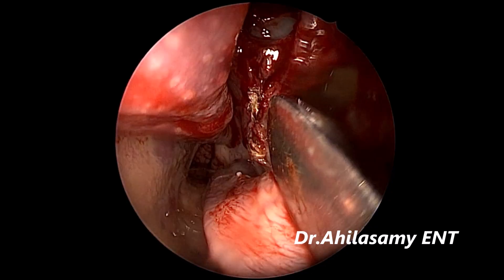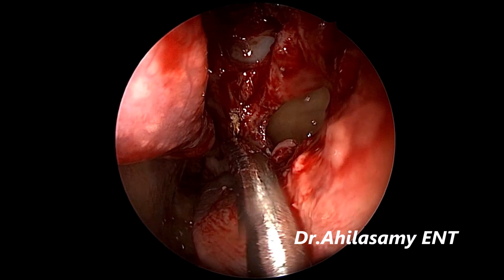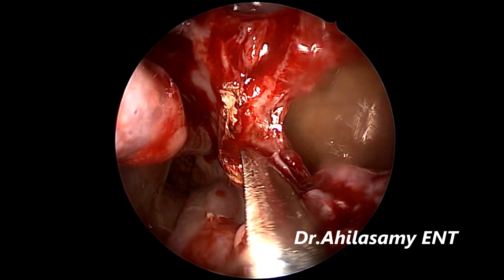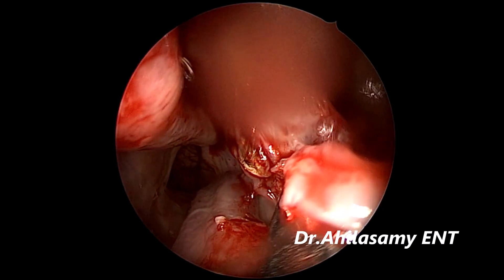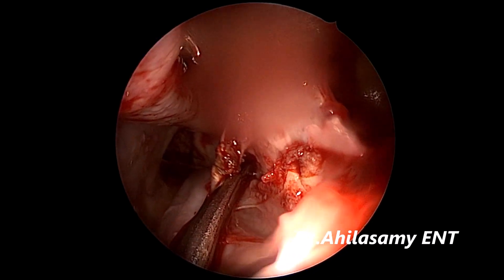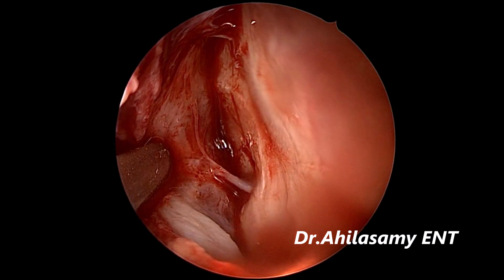Now I am going for the posterior nasal neurectomy on the left side, using an elevator — I use a PNN neurectomy elevator, or sometimes an ordinary cartilage elevator, depending on the space. Elevate the mucosa from the posterior edge of the MMA. If you have done an MMA, this is quite an easier step. Otherwise you have to make an incision at the junction of the middle turbinate. So I am elevating and you can see the thin nerve coming into view beautifully.